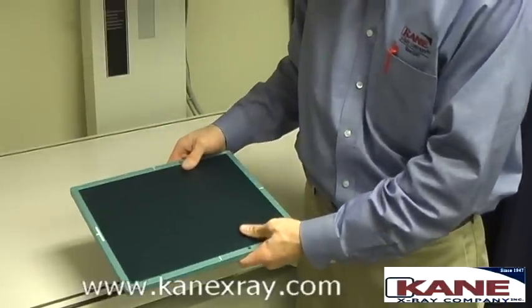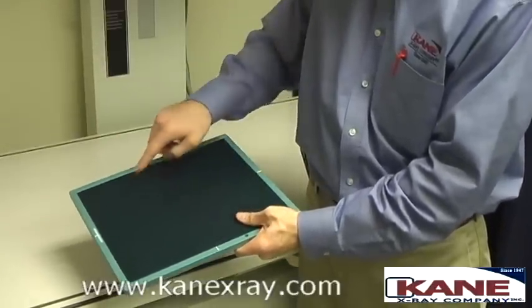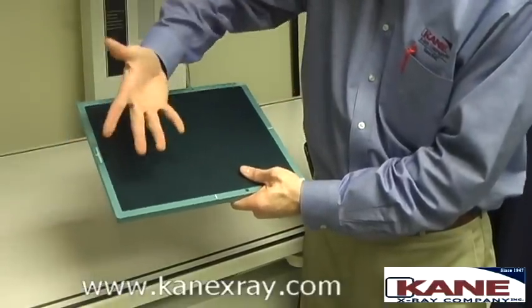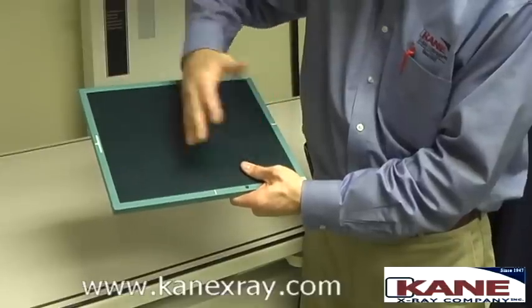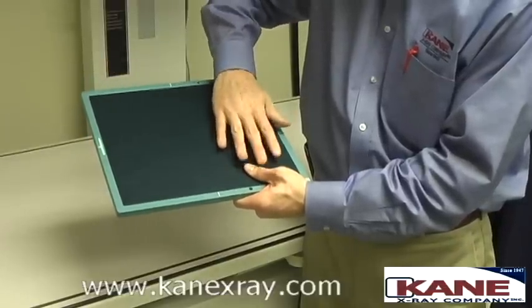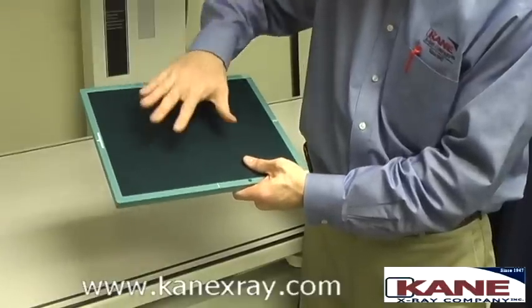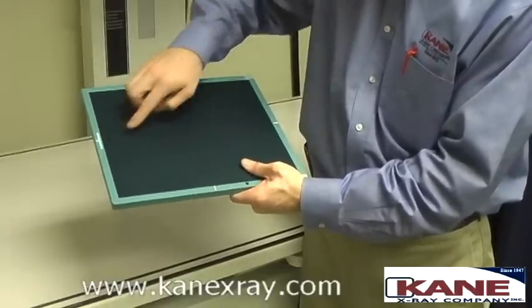When positioning the cassette, we want to get the anatomy that we're most interested in the centermost part of the cassette. We can still do the split plate view. The Fuji software will recognize 2 images on one plate or even 4 images on one plate. However, if we're only doing the one image, we want to get the anatomy in the centermost part of the cassette.